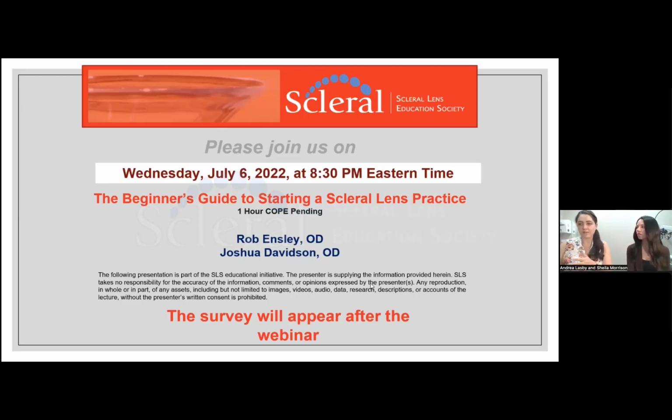At the very least, you still have a lot of warranty period with your contact lenses. You can put them in a multifocal and try it out. If you don't like it, guess what? You still have your finalized distance lenses, and you're good to go. But I would always recommend finalizing your distance power, knowing exactly what that is, before you play around with the multifocal. Because sometimes if you play around with the multifocal right away with your distance optics in there, it is way too confusing to know what part is going wrong.